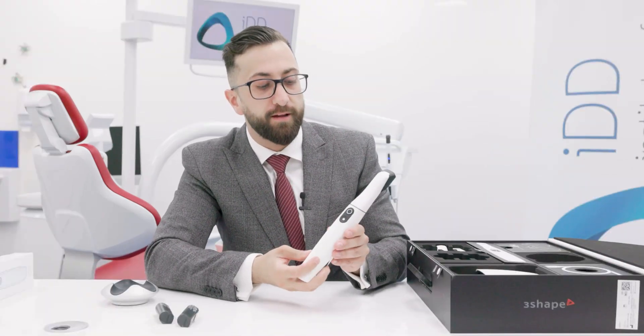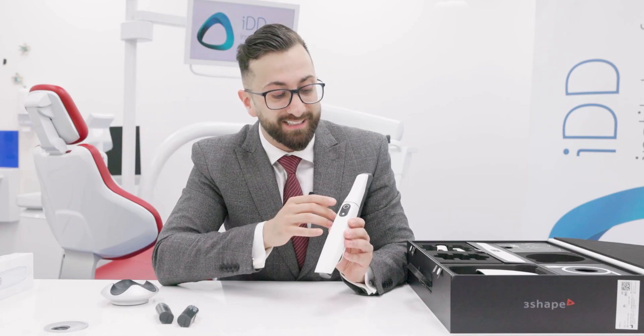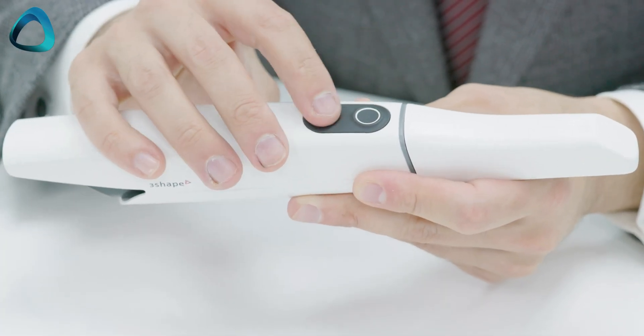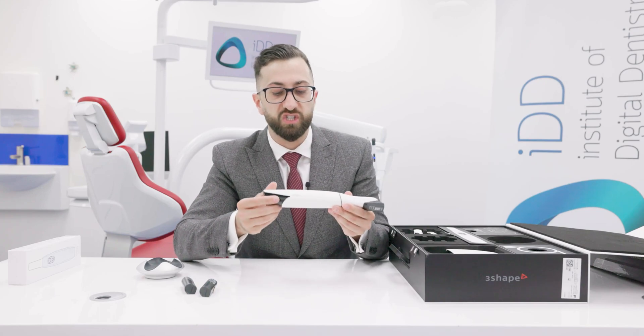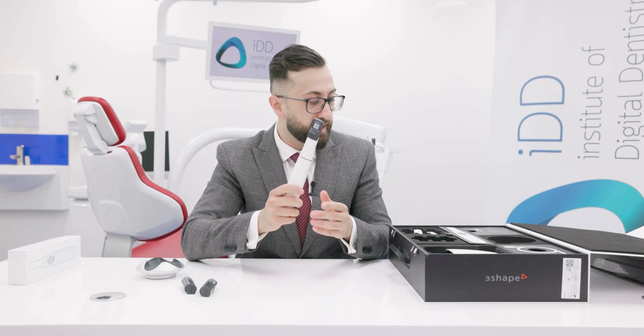Moving to the scanner design: the company may have taken some inspiration from others, but we have the scanning button and a new navigation button. This button underneath allows you to navigate the software without having to touch the laptop or screen. That's basically it — there are no other buttons. It's just a very slick design with the 3Shape logo on both sides.